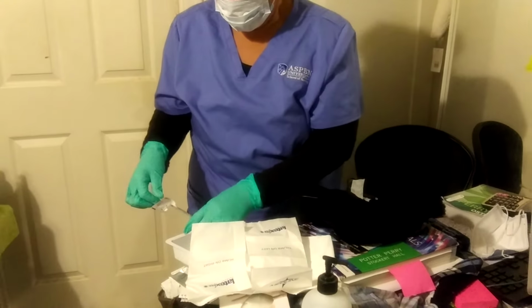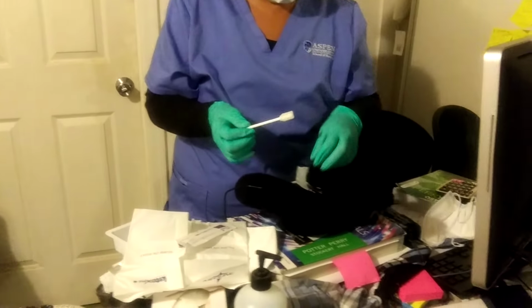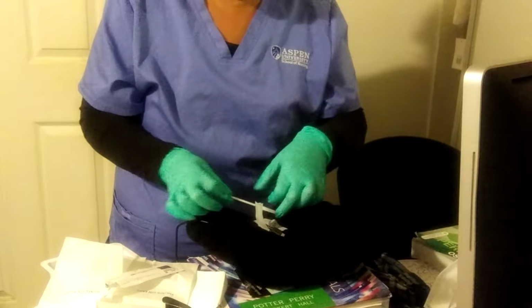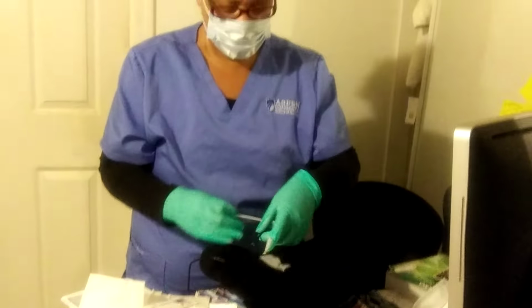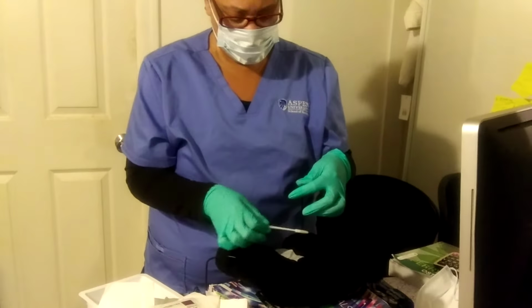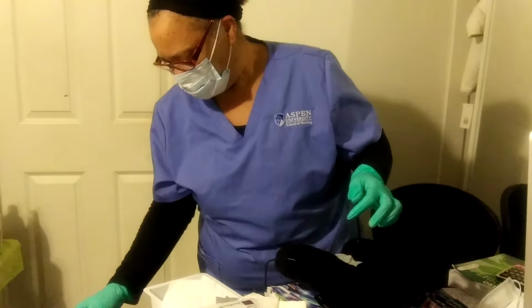Okay. I take my chlorhexidine and I will clean around the site. And I'll clean my tubing. Oh, sorry. Clean off the tubing. After I cleaned around the site, dispose of my chlorhexidine.